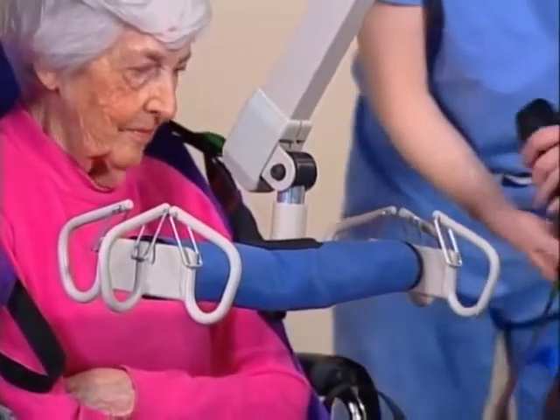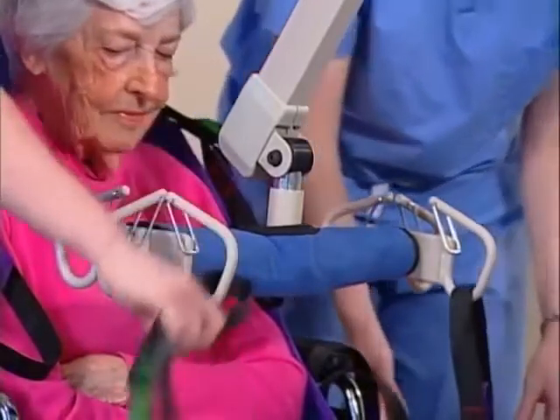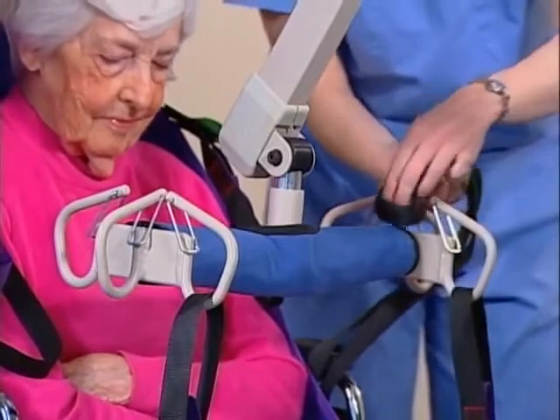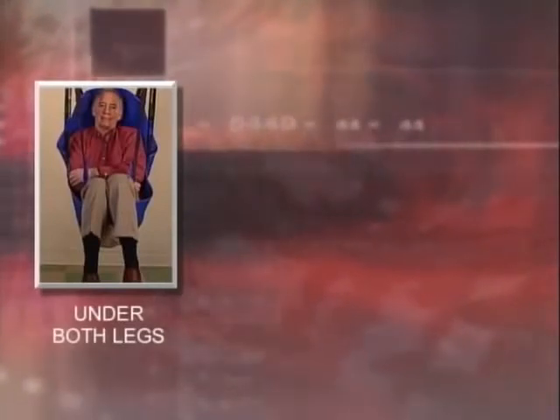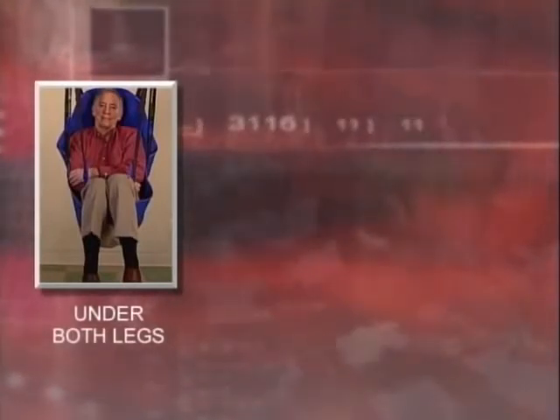Then attach the sling. Attach the straps that are by the resident's legs to the front of the swivel bar. You can use any one of 3 techniques depending on the situation. You can attach them so that the straps go under both the resident's legs. This bundling technique creates a very small opening for petite residents.